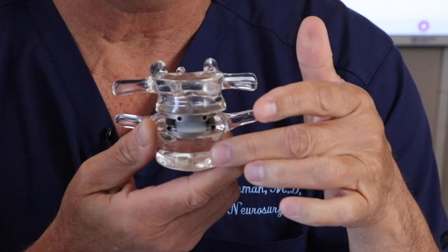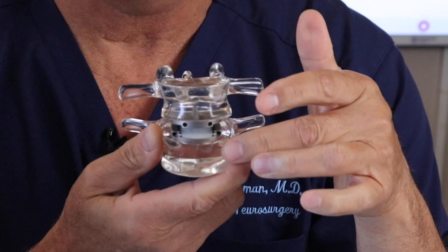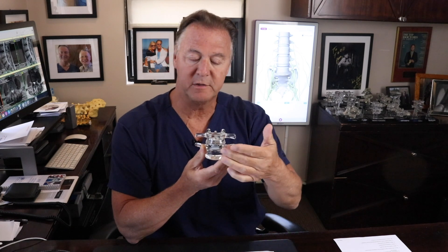I have three of these in my back. The clear acrylic you see here represents the bone. That's the artificial disc. One of the key things about an artificial disc replacement is people are getting disc pain related to degeneration of the disc, or if the disc is torn and herniated and failing, we can replace it.